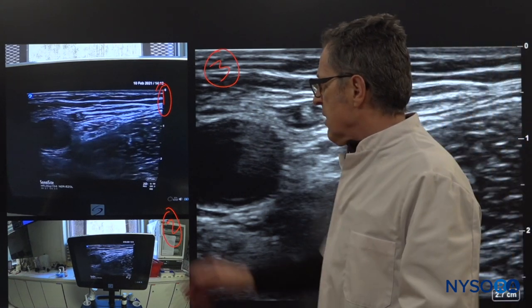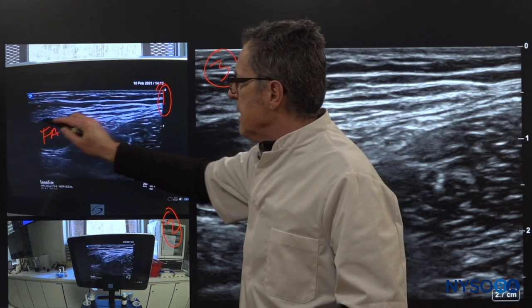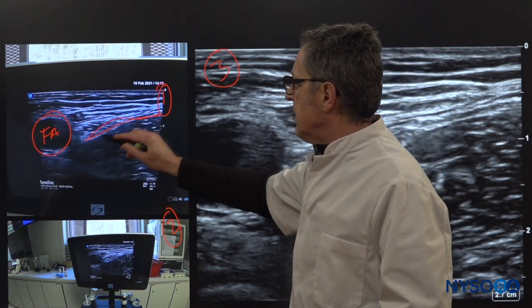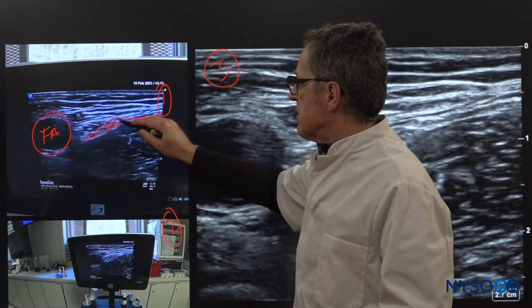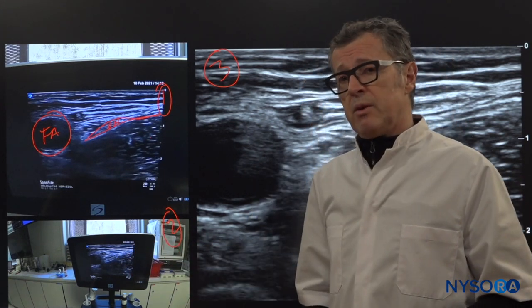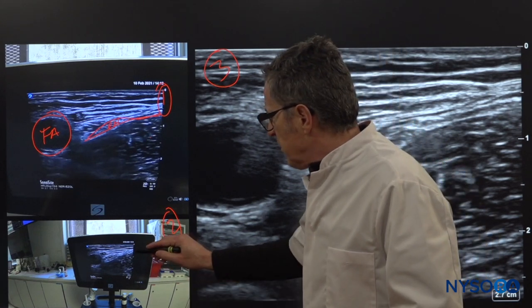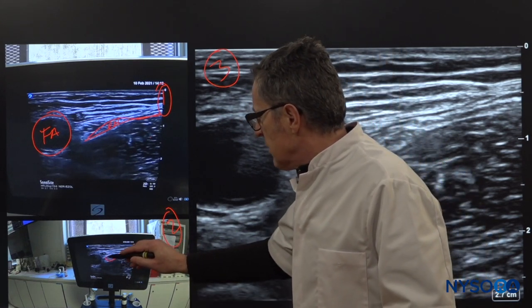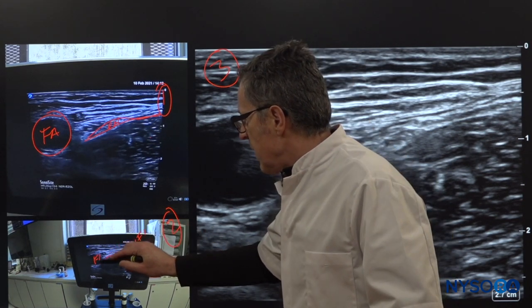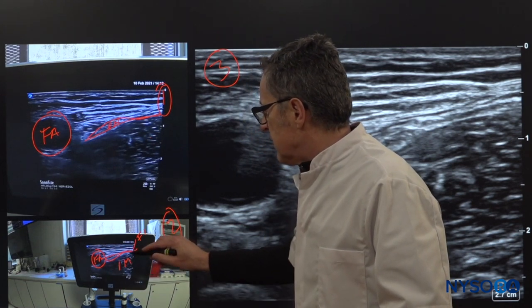In image one, I can immediately recognize the femoral artery, the fascia iliaca, and the nerve contained between the two layers of the fascia iliaca, which is the femoral nerve. In the even more zoomed-out image, it's also pretty easy to pick out the femoral nerve and the fascia iliaca, as well as the femoral artery, which is medial to it, and the iliacus muscle, which is underneath the fascia.